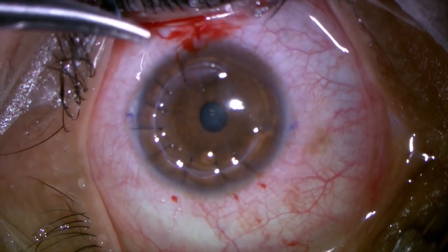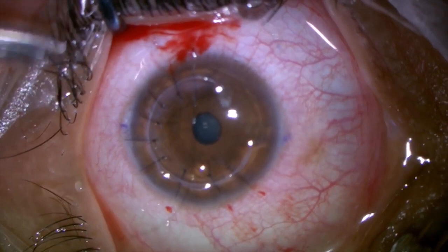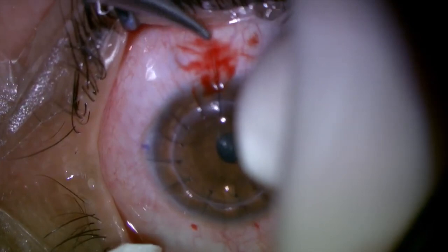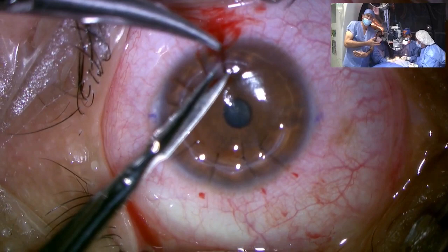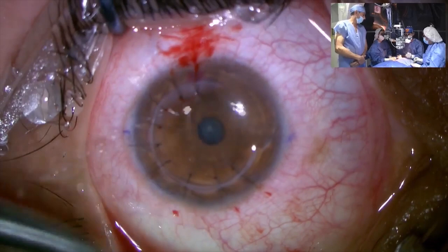Sometimes it happens because as you go deep and you follow the curve of the needle, it just happens. But again, we try to do it on the cornea and not on the limbus. It's important to say too that, in this case, the coaptation of the tissues is adequate, but we need to place other stitches between these stitches in order to have a better contact. These sutures we can remove early at 4 months, and we are removing the stitches depending on the astigmatism.